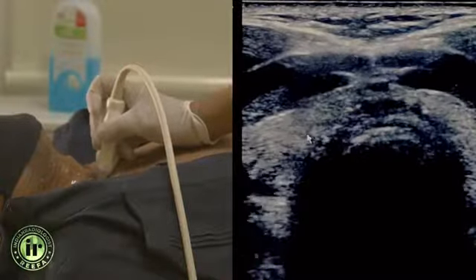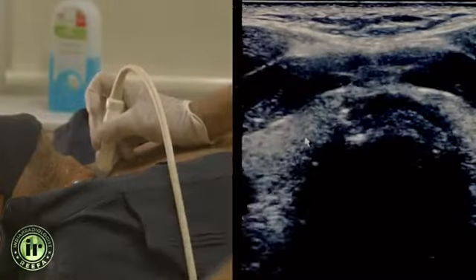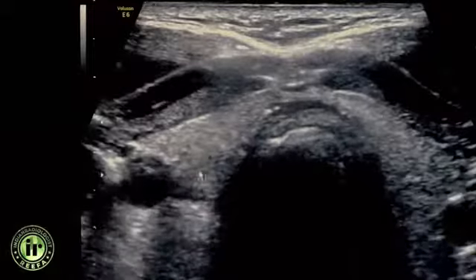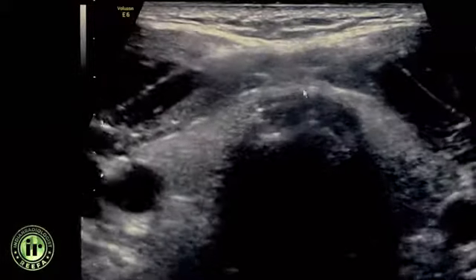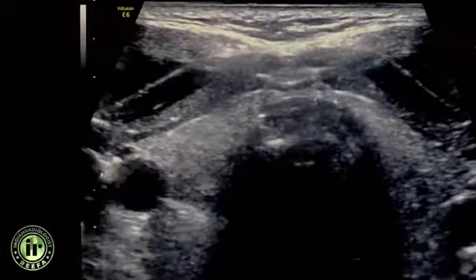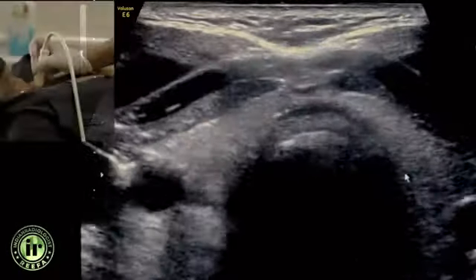and from here you gently move up until you locate the thyroid gland. Now it's again good to move to a virtual convex or a trapezoidal plane like this. So what happens is that you get a greater view of the thyroid gland. So we can see both lobes here. This is the right lobe, that is the isthmus or the bridge of the thyroid gland, and here is the left lobe or the left hemithyroid.